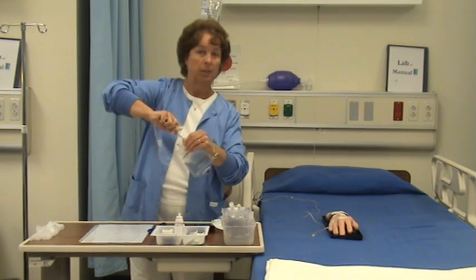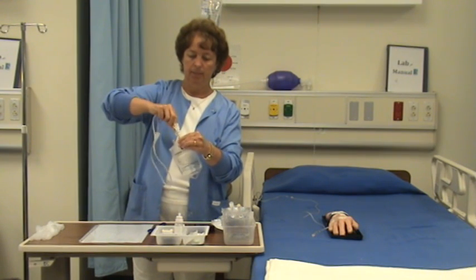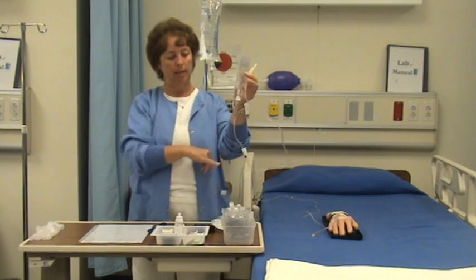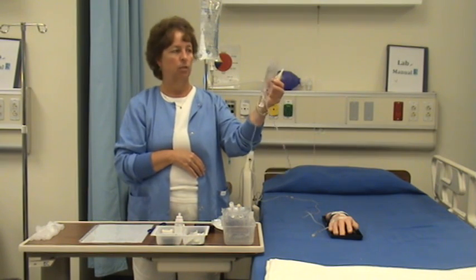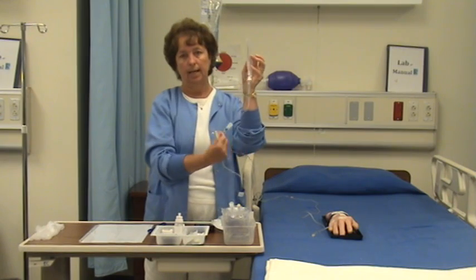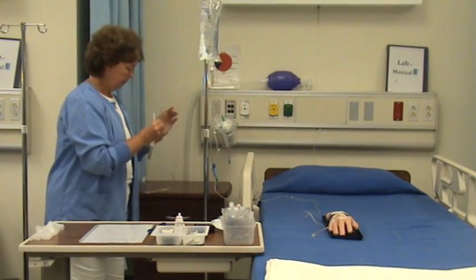This is because we're in the lab just as a whole, but you would probably have to flip the top off the medication. And now I'm going to turn it over and prime my tubing. Now if you hadn't closed that clamp, your fluid's going to be pouring out of your tubing, and you only have 100 milliliters of solution, so you could potentially lose half of your drug if you did not have your tube clamped. And now I'm going to prime my tubing.